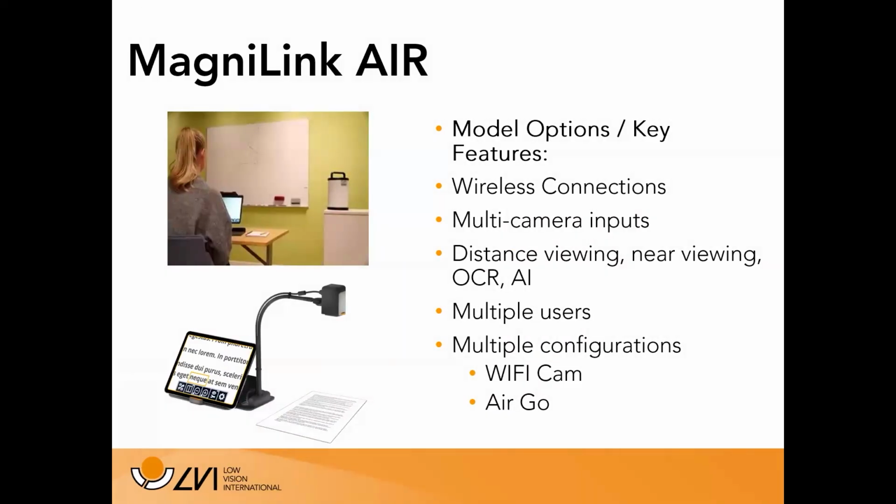So the magic with the Magnilink Air system is wireless connections. I'm going to highlight a couple of products that are shown on the screen here, and then I'll describe a third one that actually is popular with iPad users.